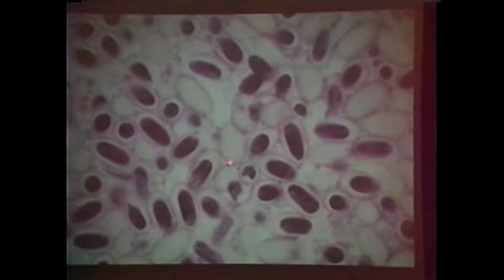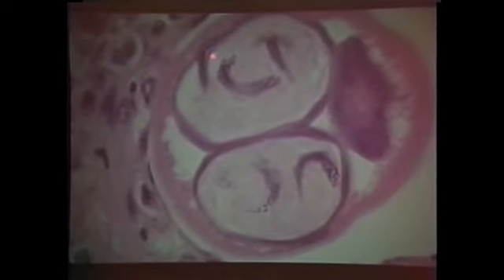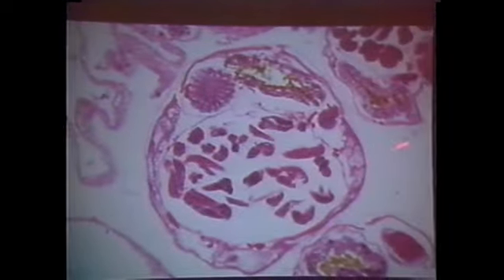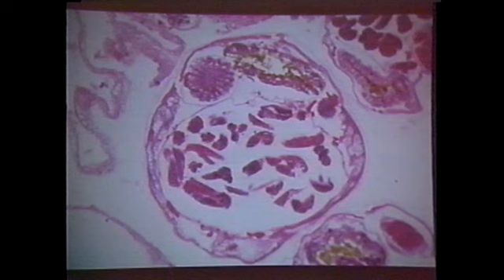Sometimes eggs are very small and contain a larva. Sometimes the females contain larvae themselves. You're going to use all these characteristics when you go to identify them. Many times people don't know the difference between microfilariae, which are a kind of larval form, and the true larvae that you see passed out in feces. Microfilariae are usually just a sack of little nuclei. You really see no esophagus or other structures. Whereas if you look at these, there's more to it than just a group of little nuclei. That's how you can tell your larva from your microfilariae.